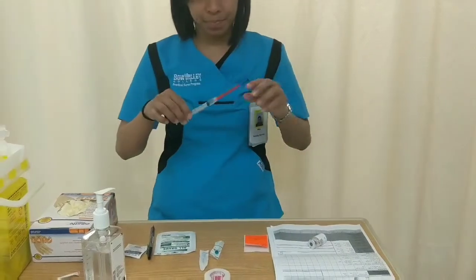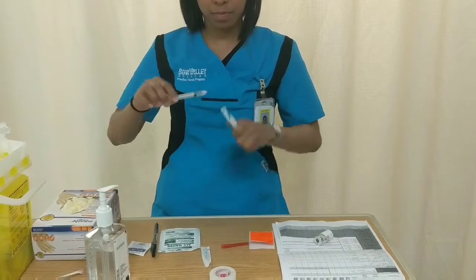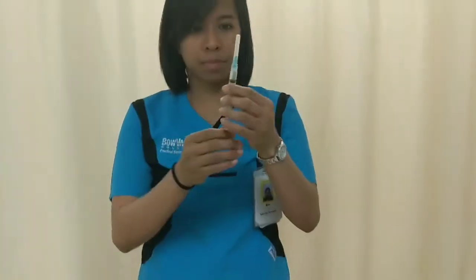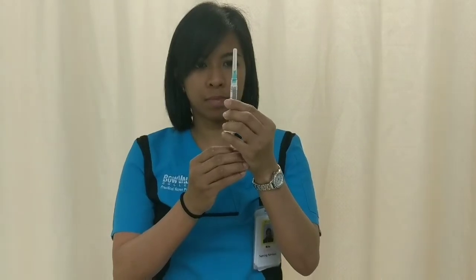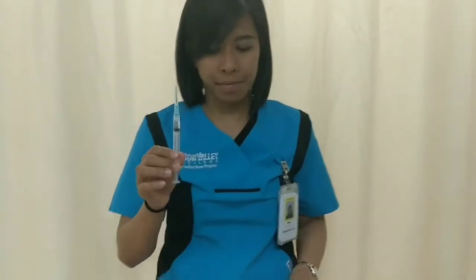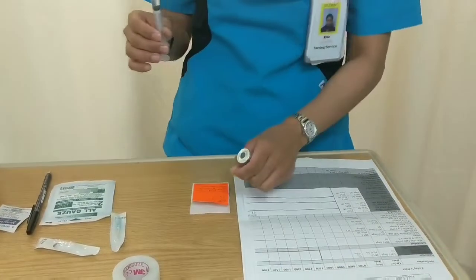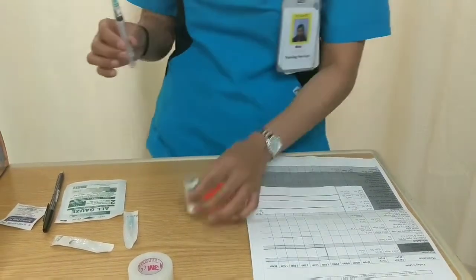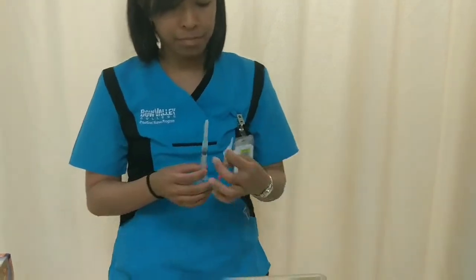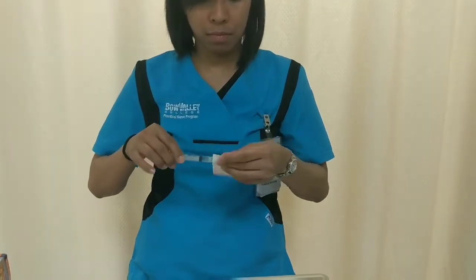After aspirating the right dose, you may now change the blunt needle. Then prime the needle and avoid contaminating it. You can now do your label on top of your MAR with your medication in your hand to make sure that you have the right volume and ensure the patient's 7 rights.